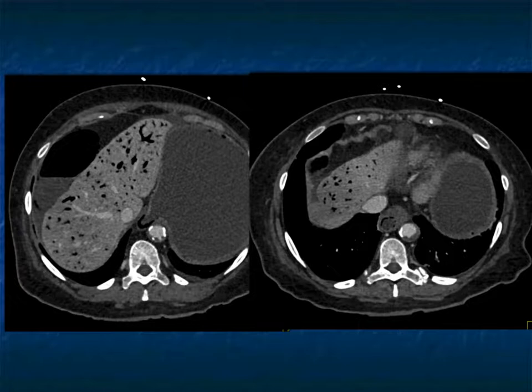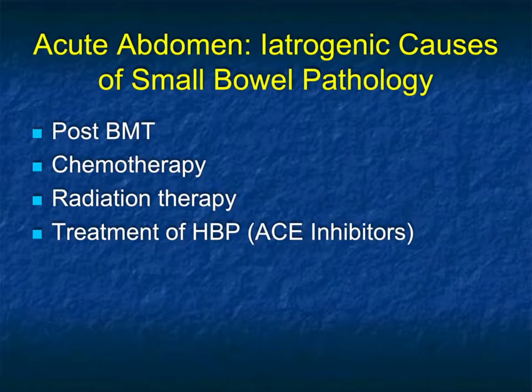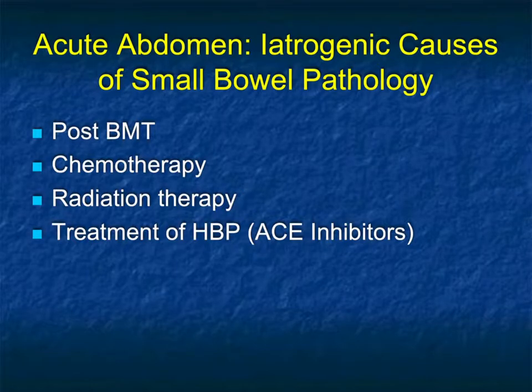Here's another example: pneumoperitoneum and really extensive air in the portal venous system. At this point, with this appearance, when I scan further down, the bowel is going to look terrible and this patient is not going to do well.